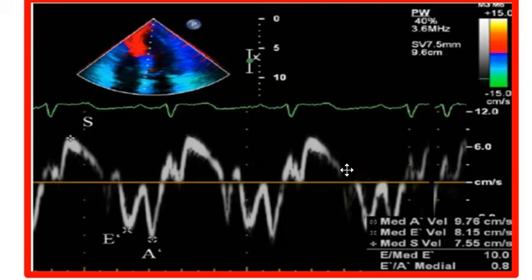And here's an example of tissue Doppler imaging. This is our left ventricle up here. We've turned on our TDI. Anything that's contracting and moving towards our transducer is red. Anything that's relaxing is blue. Similar to blood, you can see here red towards, blue away. You can see the scale here, where our scale in Doppler is somewhere around 60 centimeters per second, our scale here is 15 centimeters per second. That's because we're measuring the actual movement of the base of this heart, the tissue itself.